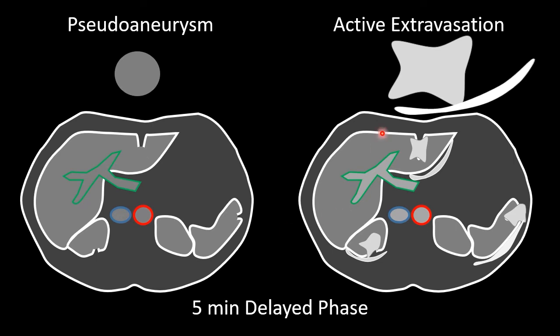Another feature you can see with active extravasation is what I would refer to as pooling. As the bleeding continues and the contrast continues to accumulate in that injury, you can see contrast that starts to pool or spread in dependent spaces adjacent to the organ of injury — often in the perisplenic space, the perinephric space, under the surface of the left hemiliver, or even in Morrison's pouch with injuries of the right hemiliver. You can also sometimes identify this pooling of contrast within the pericolic gutters or the peritoneal space more generally, indicating hemoperitoneum.